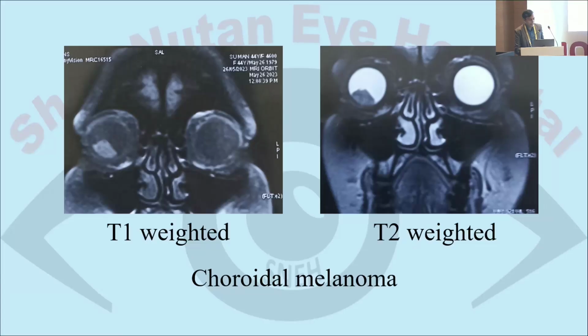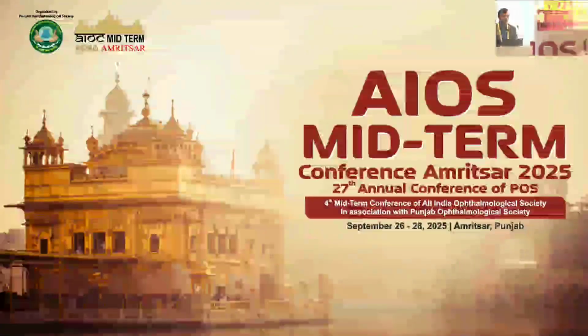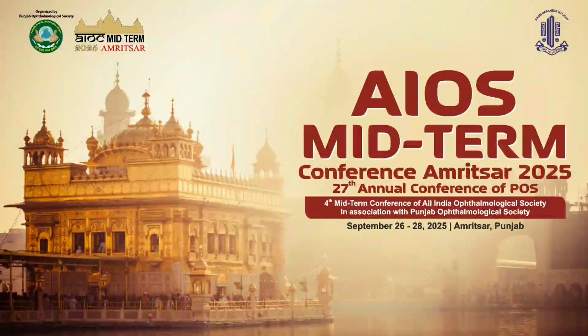Thank you very much. Sir, do you have anything to discuss? Anything from the audience? Your view on CT scan and MRI. Who all does orbit here? So what's your preference in your practice?